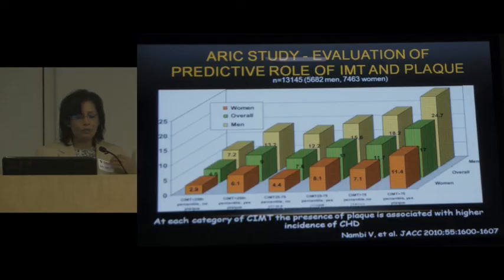And just by using that very simple measure, you can see that those patients who had a plaque thickness of more than 1.9 millimeter, about 400 individuals, have a higher probability of event at follow-up compared to those who had no plaque. Interestingly enough, 44% of Framingham low-risk individuals became 20% risk if you actually use this definition of carotid plaque thickness of more than 1.9 millimeter.